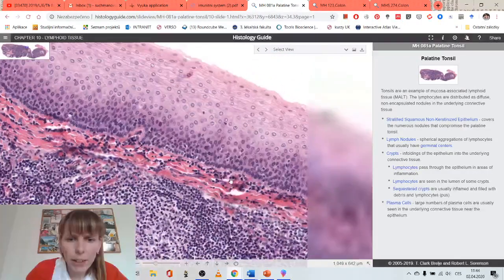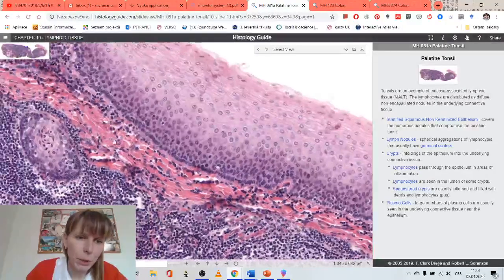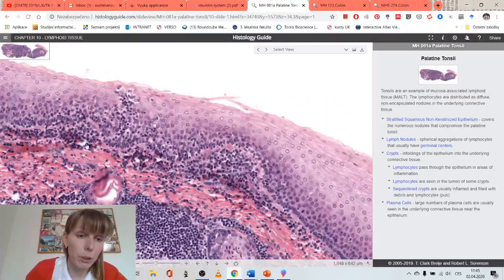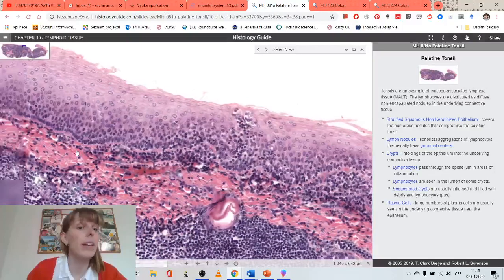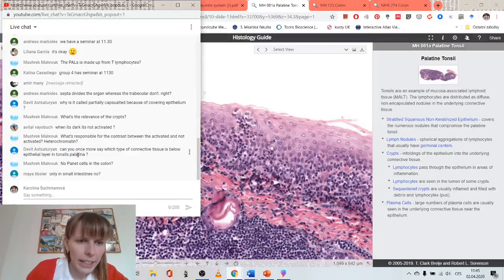So you will have lamina propria, a little bit of loose connective tissue, and then a little bit of dense irregular, because here you see a lot of collagen type 1. But there will for sure be a little bit of loose connective tissue just underneath the epithelium, normal lamina propria, as in the rest of the oral cavity and the esophagus. So I think that's clear.